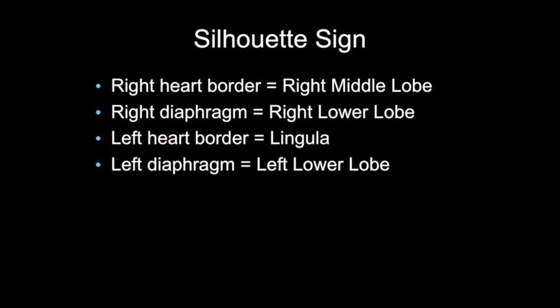The silhouette sign helps figure out which part of the lung the consolidation is in. If the right heart border is silhouetted, you're dealing with right middle lobe pathology. The right diaphragm silhouette indicates right lower lobe pathology. The left heart border indicates lingula involvement. And if the left diaphragm is silhouetted, the left lower lobe is involved.